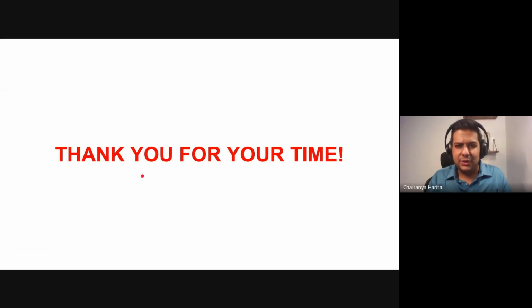So with that, today's ECG session is done. I just focused on the basics today, so I'm hoping that all of you would be able to understand how to interpret an ECG. I will share my PPT, of course, once the second class is done. Go back to Life in the Fast Lane, or whatever book you want to read on how to read an ECG. Goldberger, if possible, is a very good book to read. You just need to understand how to read an ECG.